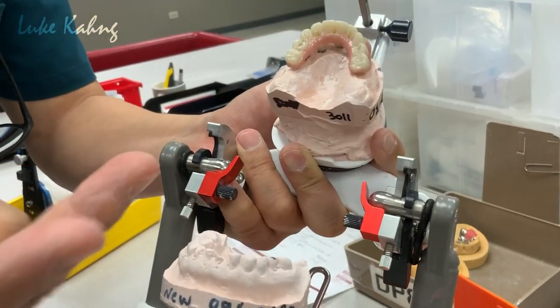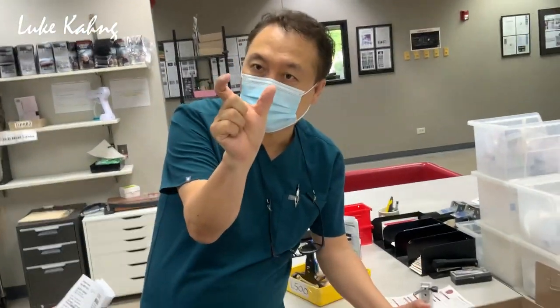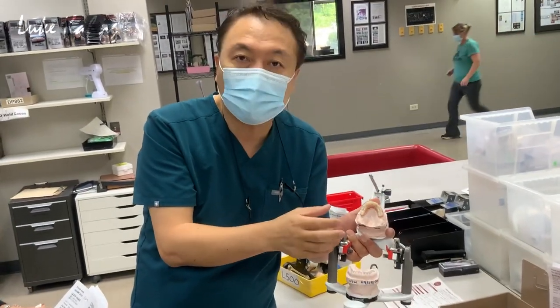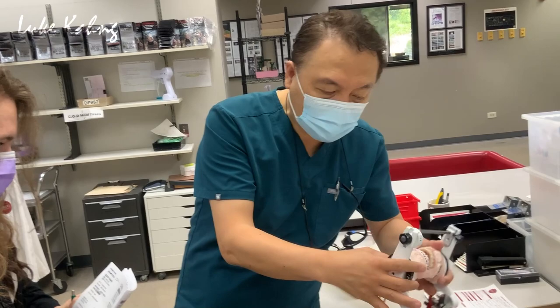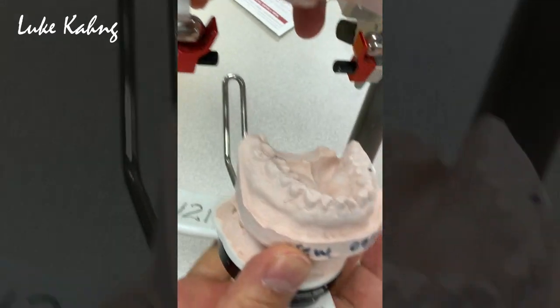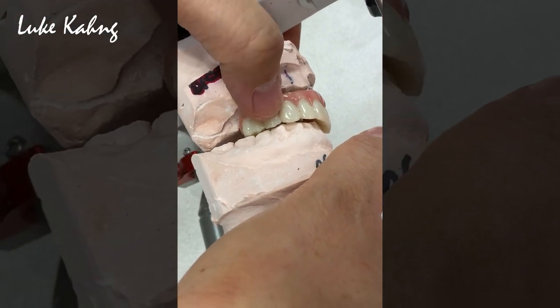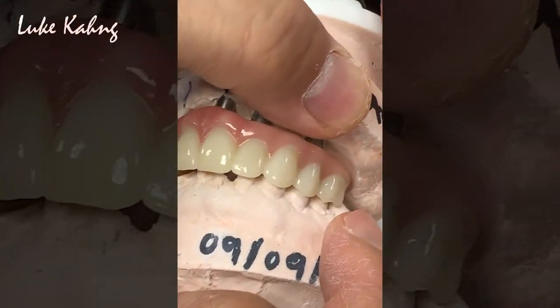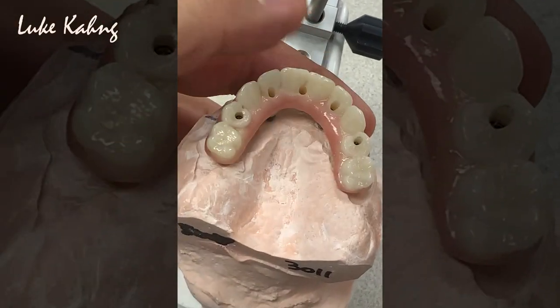And then second, I have to see the implant pontic size. Implant pontic size too large is a huge problem, but that one is not bad, pretty good. So this is more important. Number three, I have to see the occlusion contact. The problem, like I said, this is natural teeth. The problem is the contact. It is subtle, it's a huge open contact. This is good, but a little bit of interference. So that's why probably this patient has four or five zirconia breaks.